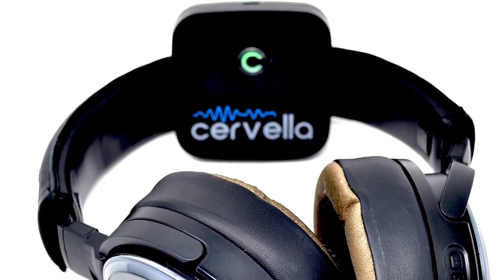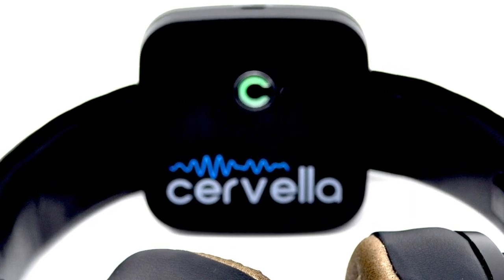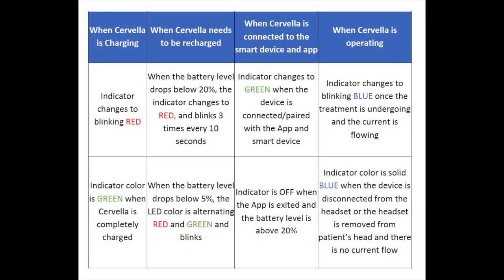The Cervella main device features a special tricolor LED status indicator which tells you about the state of the device. See the owner's manual for a detailed explanation of the various LED colors.